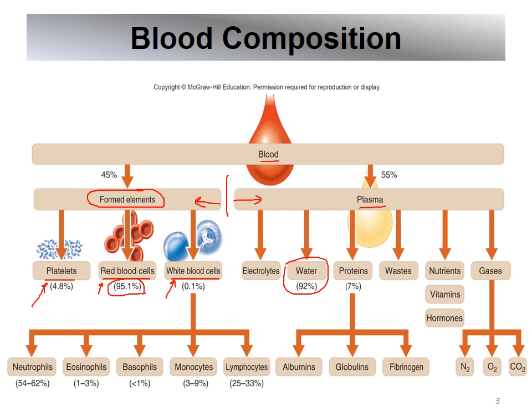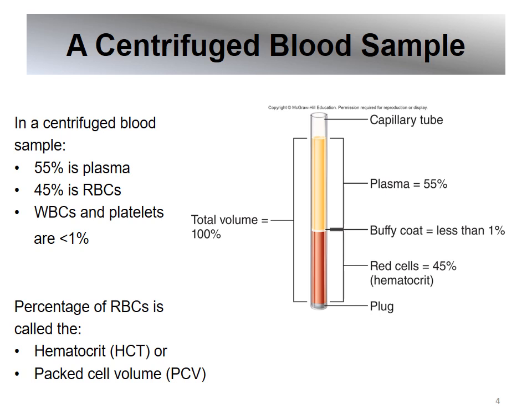So the first part of this lab, we're going to look at, like I said, the divisions here. Then we're going to look at white blood cells, and then we're going to talk about red blood cells or erythrocytes. So what I want you to know is how whole blood is looked at, and how doctors and medical providers look at blood and how they use it.